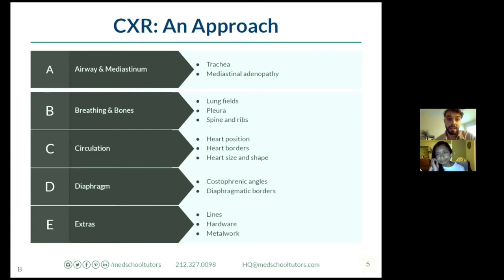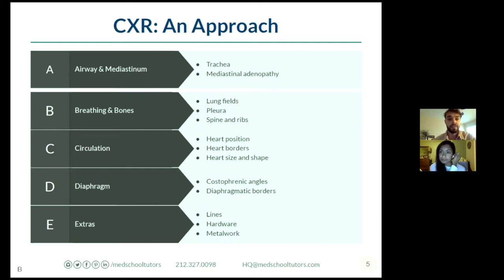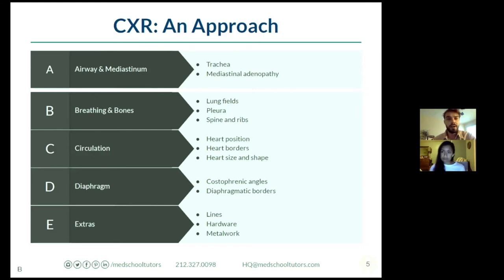You do not want to miss D. When looking at D, always look for free air under the diaphragms. Look at the diaphragm borders, particularly the costophrenic angles for effusions. Greater than one centimeter on lateral decubitus, you want to get some fluid for assessment. And then look at everything else - particularly at the top borders to make sure the lung fields are equal there, because pneumothoraces are also a pretty common diagnosis.